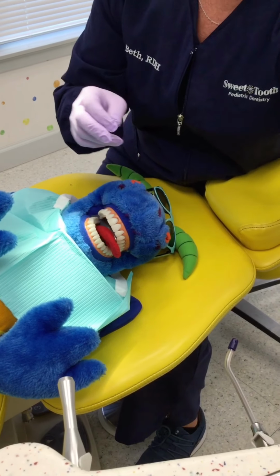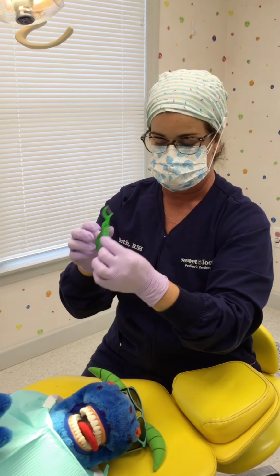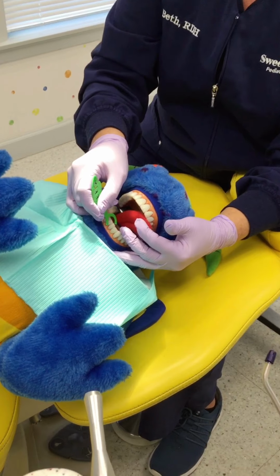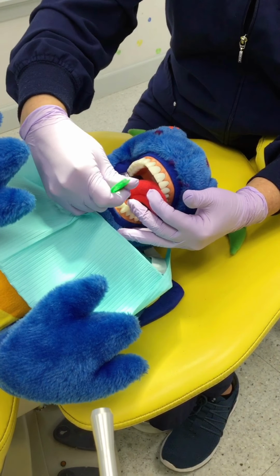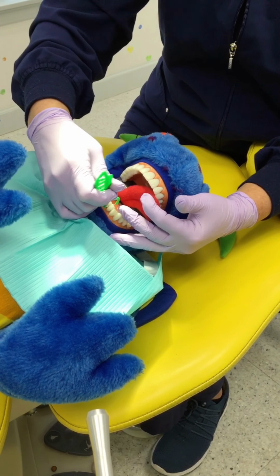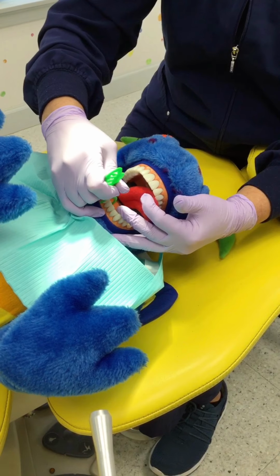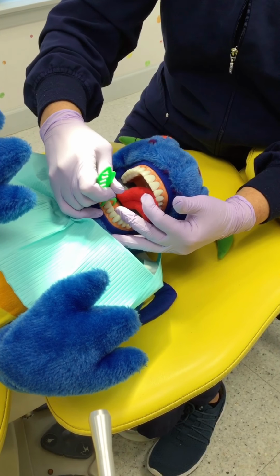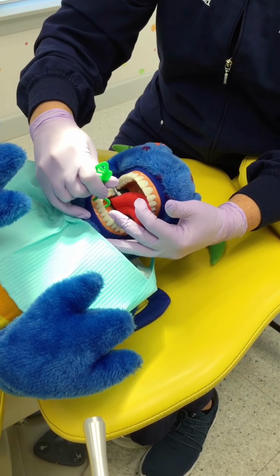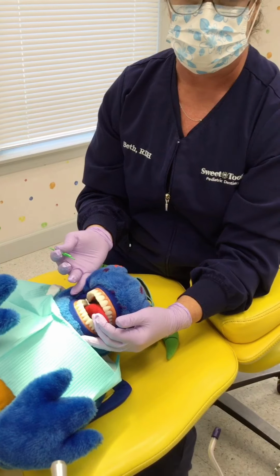And then this is where maybe our flosser can really come in handy. So we've got a little plastic handle guy. This guy's going to go working back and forth between the teeth to help make sure that they feel super smooth, and hopefully I can get them in there right like that. And up and down and up and down, and we'll work it right back out again. His teeth are pretty tight together. Right, up and down. If you have big spaces between your teeth, we probably wouldn't really need to do this very much. All right, but we would go around all the teeth with that.